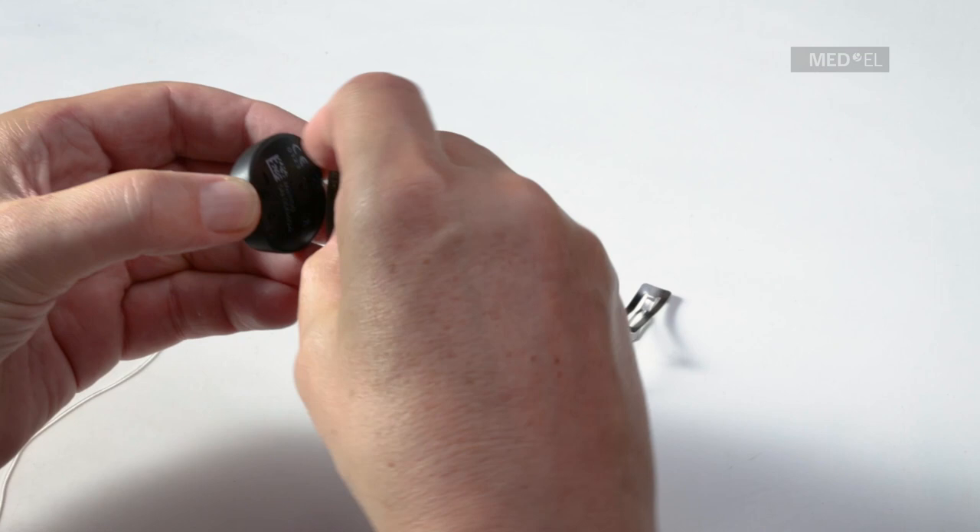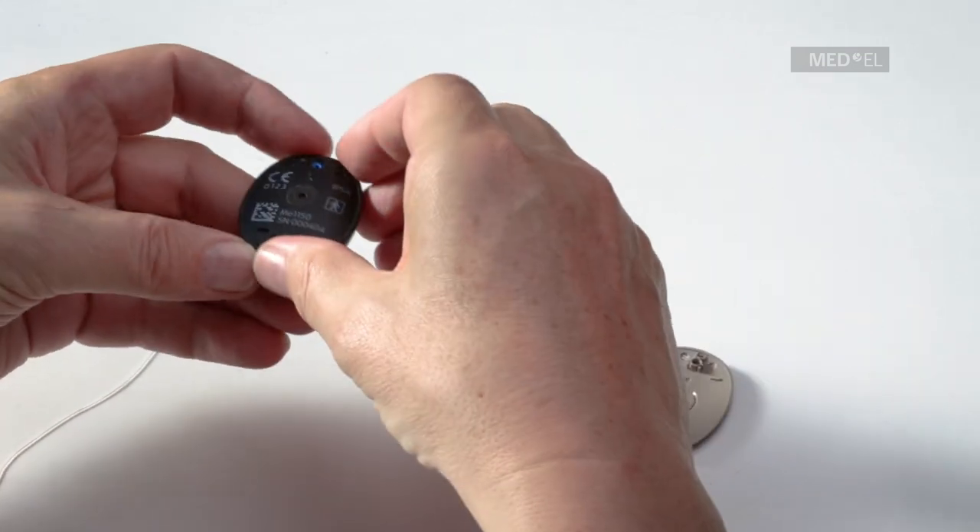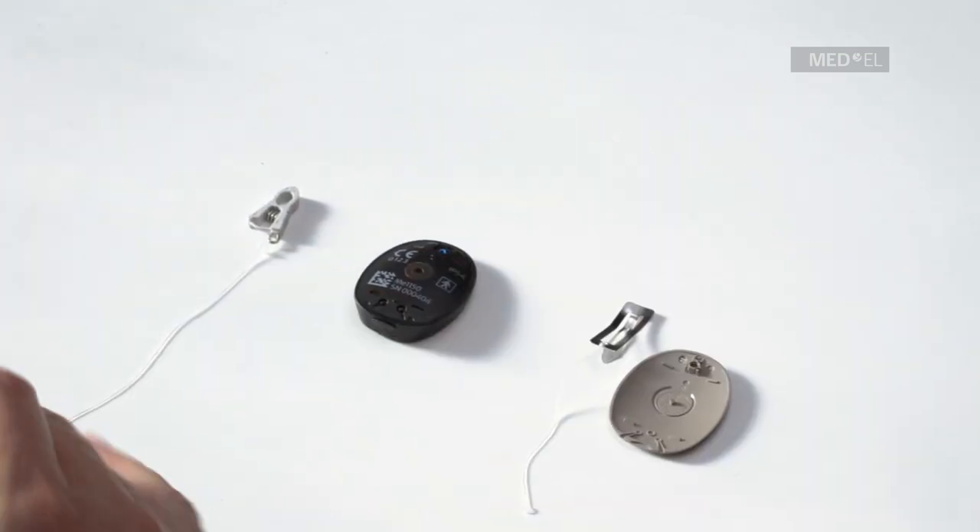There are two types of clip: the hair attachment clip and the clothes attachment clip. Both are attached to RONDO 2 in the same way.